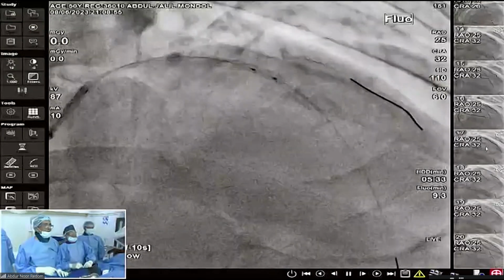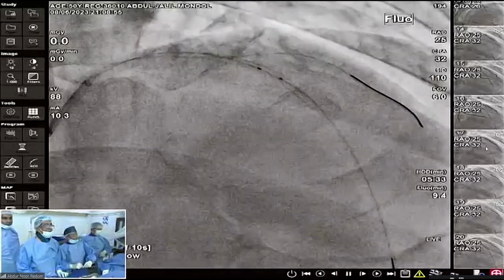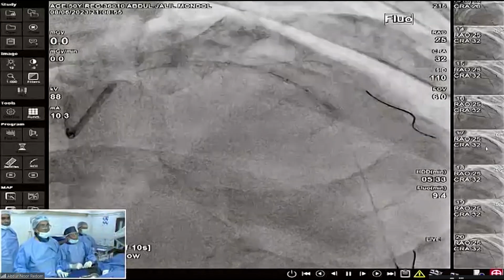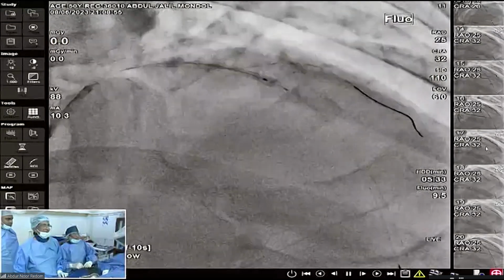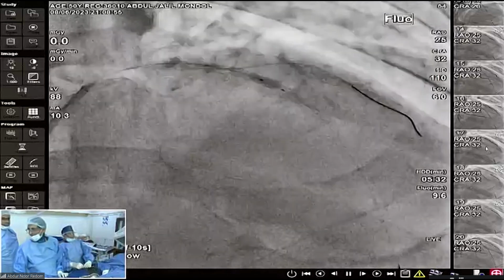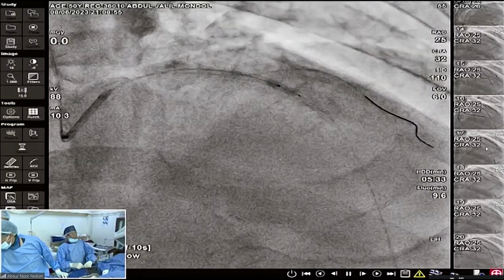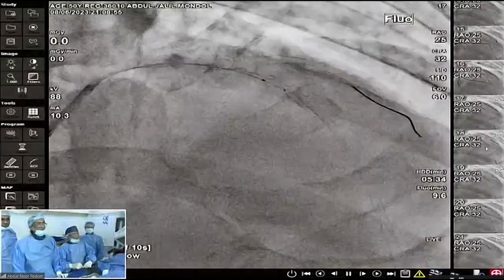You're right. I think we can go just a little bit up to this and dilate it. Yes, 4. That is why my strategy is to go sequential, like 3.5 for the entire body and the proximal part with a higher size. Deflate. Yeah. Come back and next one will be fine.